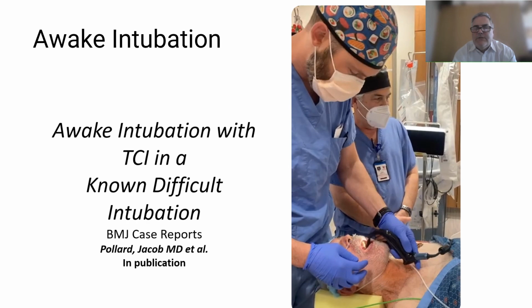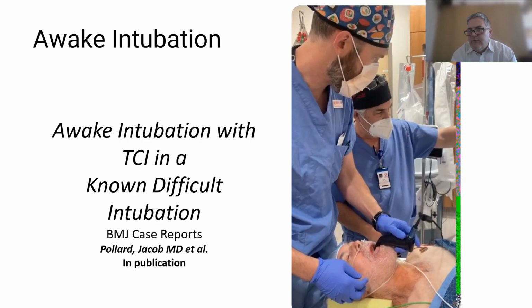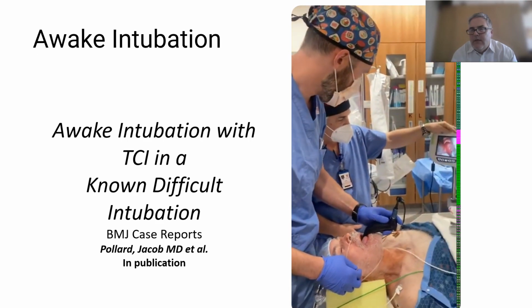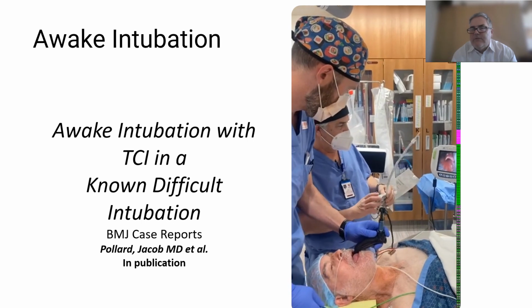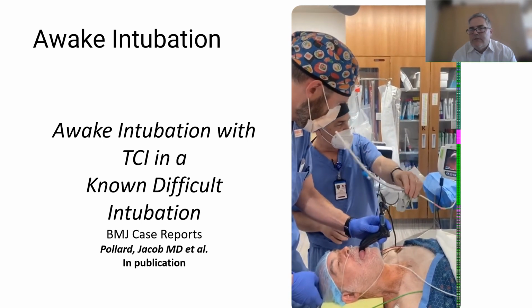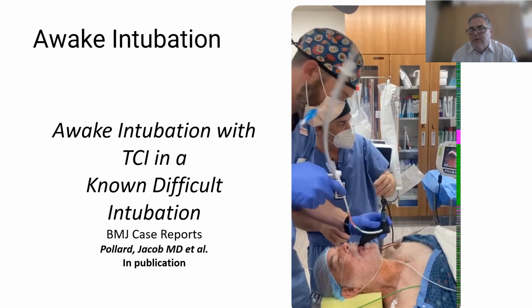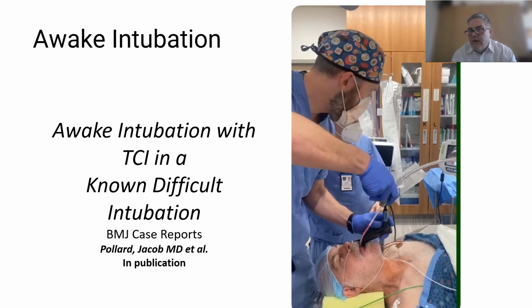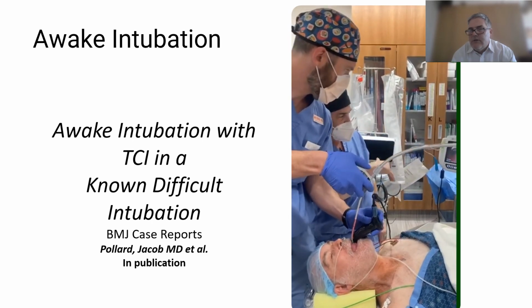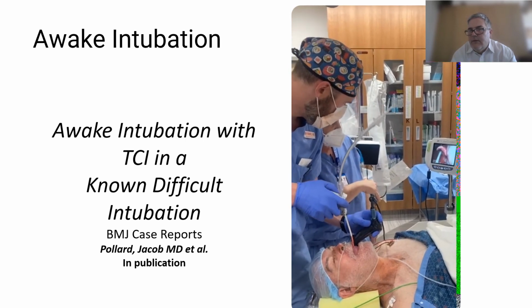Awake intubation is a very powerful use of this technique. It's a gentleman with a radiated neck and a glottic or base of tongue tumor. This is one of my residents who's never used the device before, but I'm walking him through the technique. Video laryngoscope goes in, the patient's awake and his airway's topicalized. And because there's not a lot of force on tissue, he tolerates the procedure very well.